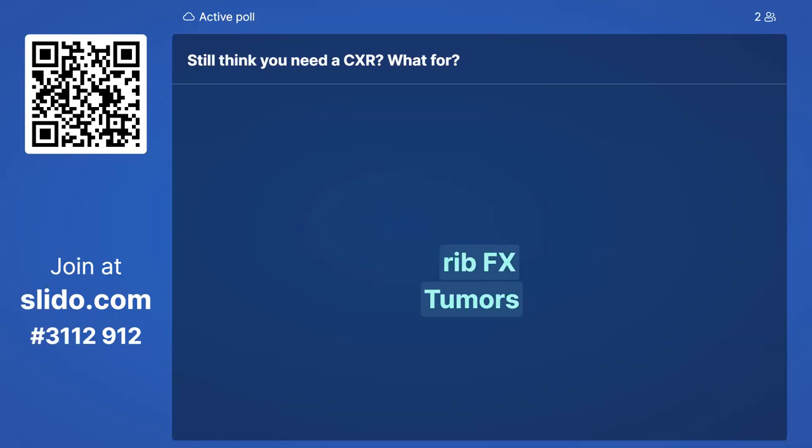What about determining lung sizes for donation? Quick and dirty, you probably need to get a CT or chest x-ray for donation. Juliana, you could determine lung size with the ultrasound, it would probably take longer.